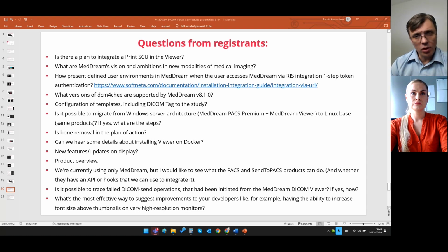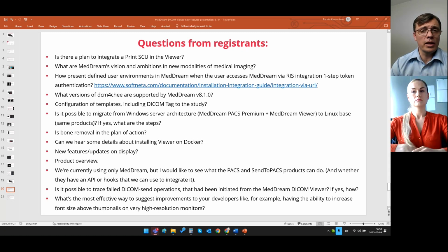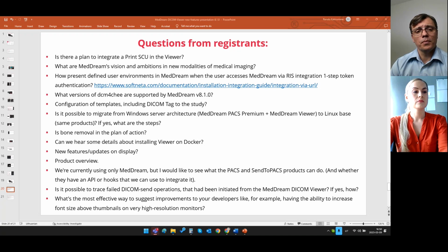I'm not 100% sure I understood the question correctly, but if we speak about our reporting system, the question is whether it could automatically apply templates already created by a doctor using the DICOM tags. So I would say no, at this point such functionality is not created, but our reporting could automatically try to apply some group of our reporting, if I understood the question correctly.